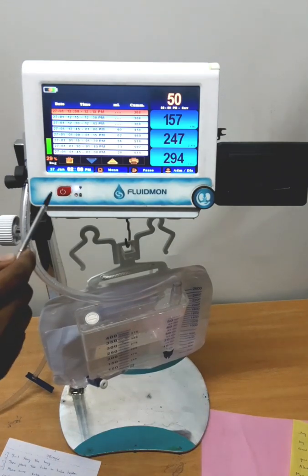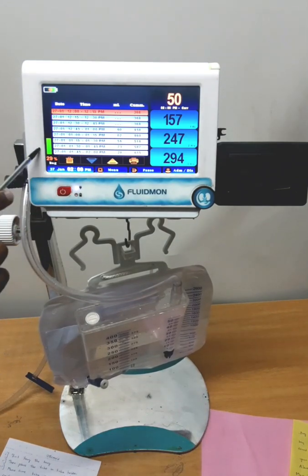It indicates the level of the urine bag. This is the bag level indicator. The bag level indicator depends on the bag being used.